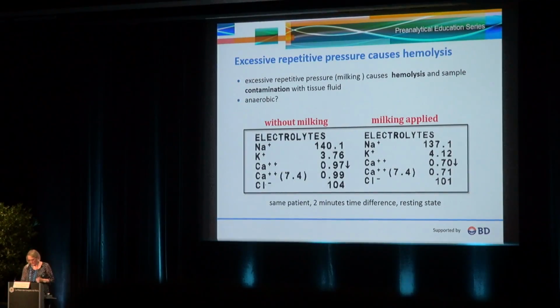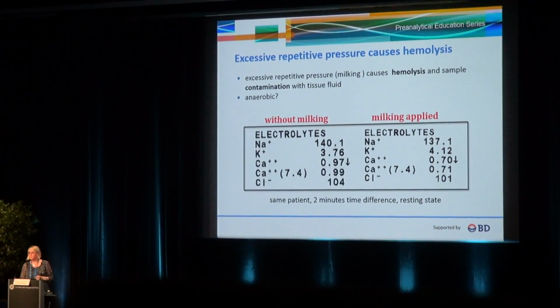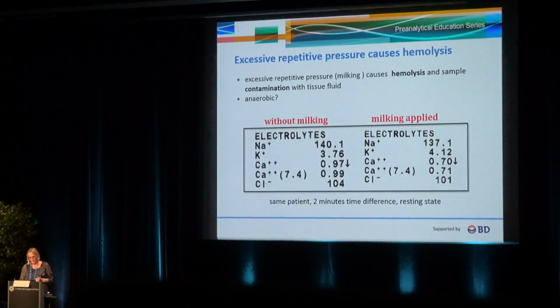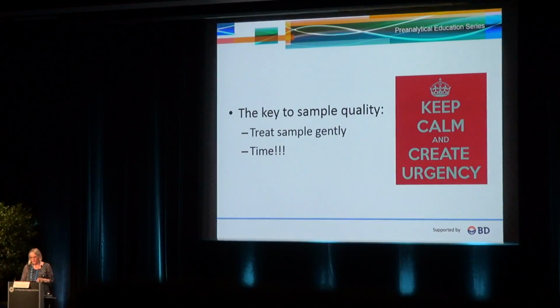interstitial fluid. So do not milk your fingers, do the arterialization instead. And do not use fingers because earlobe is recommended. And finally, sample transport and handling.